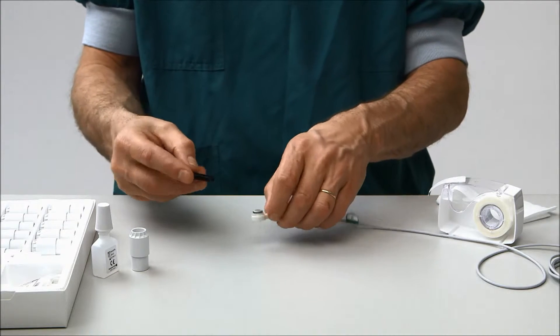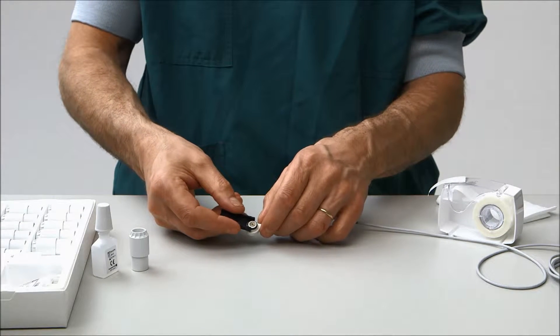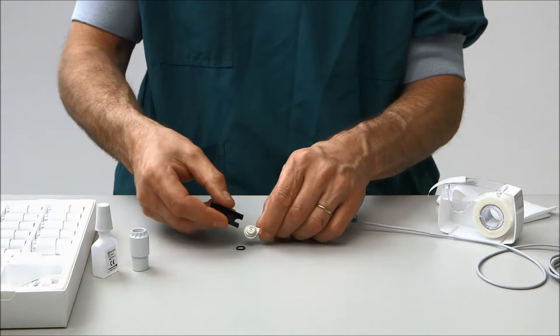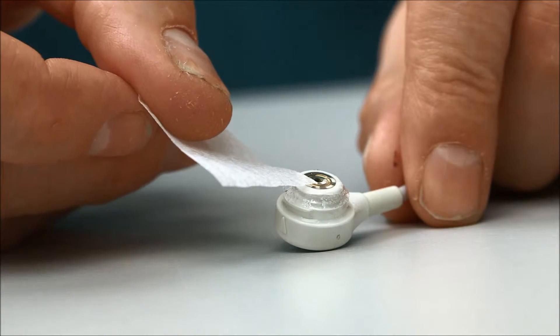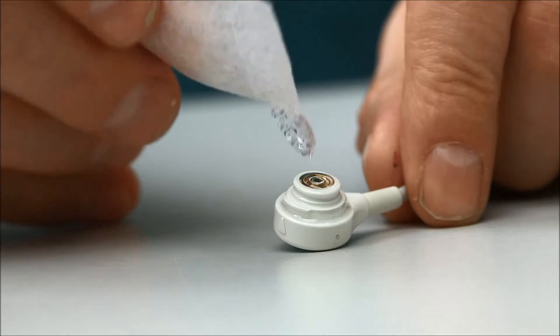First, remove the old O-rings using the O-ring removal tool. Next, take a piece of tape, touch the corner of the tape to the membrane surface, and lift the membrane right off.